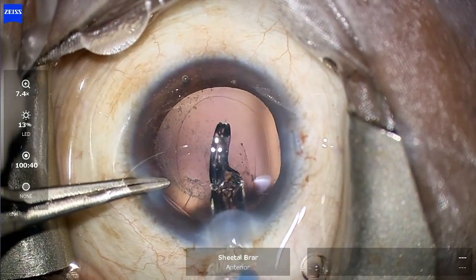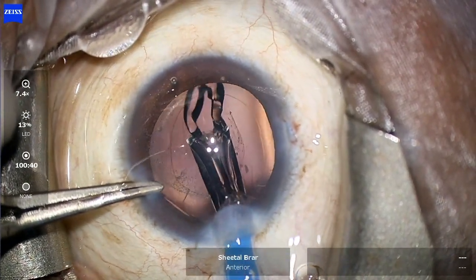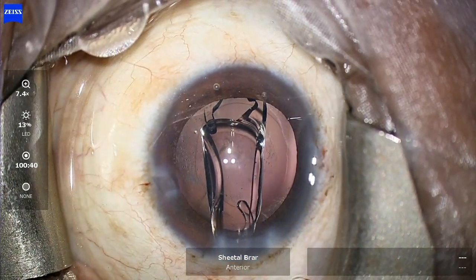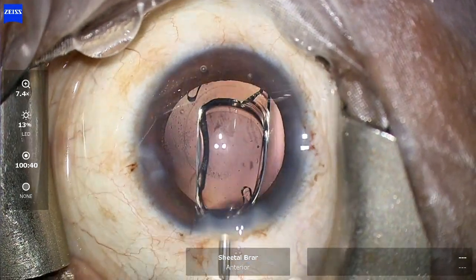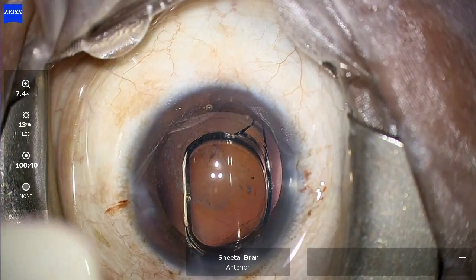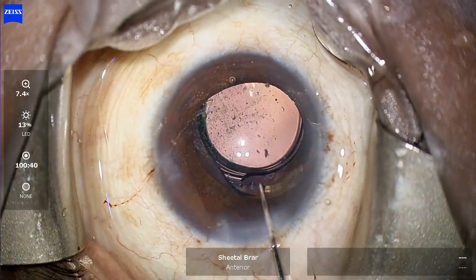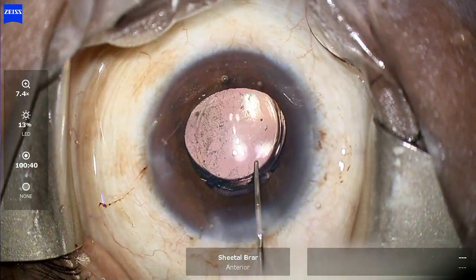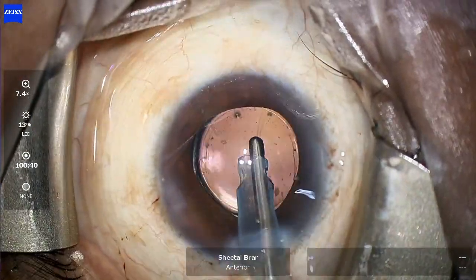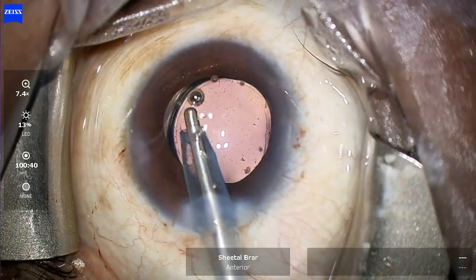I go ahead with the implantation of a single-piece hydrophobic intraocular lens into the capsular bag. The trailing haptic, however, does not go into the bag, so rather than dialing the lens, I use my Sinski hook to fold the haptic and then gently release it inside the capsular bag.